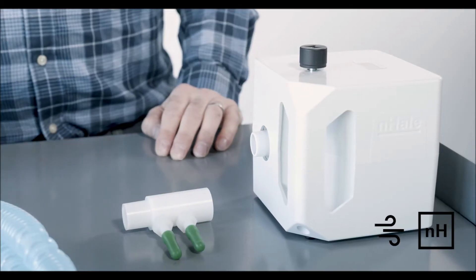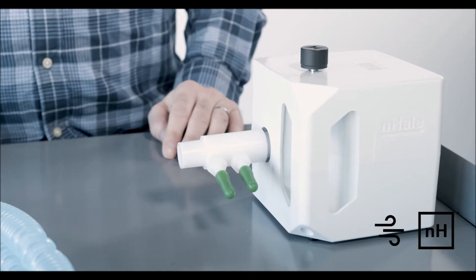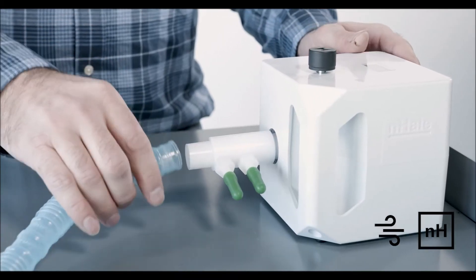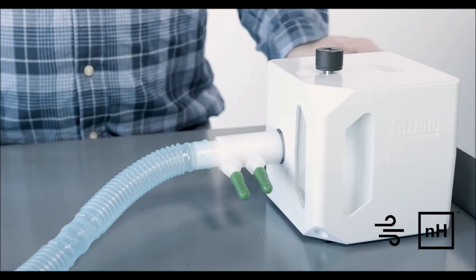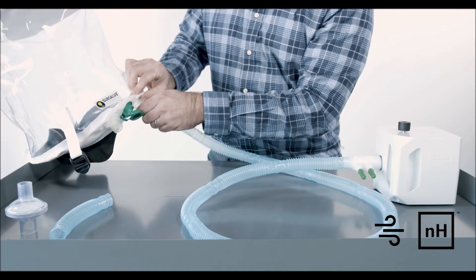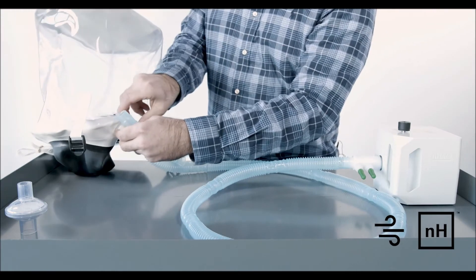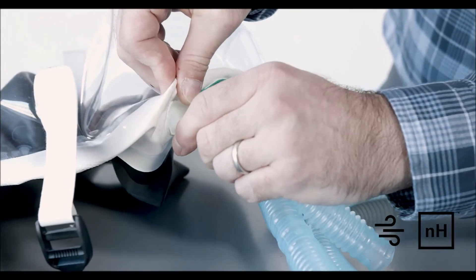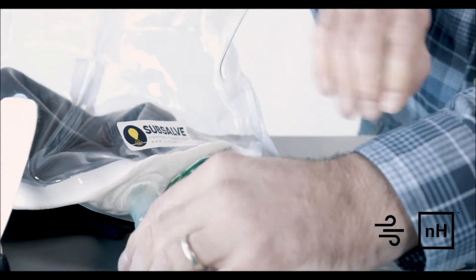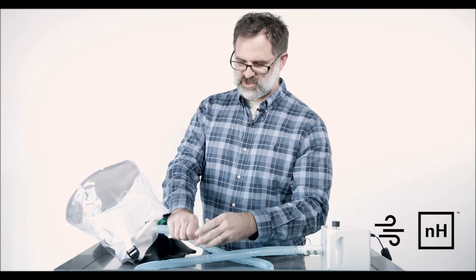To assemble the system, friction fit the dual barb adapter to the nHale. Next, connect the 1.8-meter hose section to the dual barb fitting. Connect the other end of the tubing to either port in the oxygen hood. Connect the small 100 cc section to the other port of the oxygen hood. And last, fit the viral filter to the end of the short section of tubing.